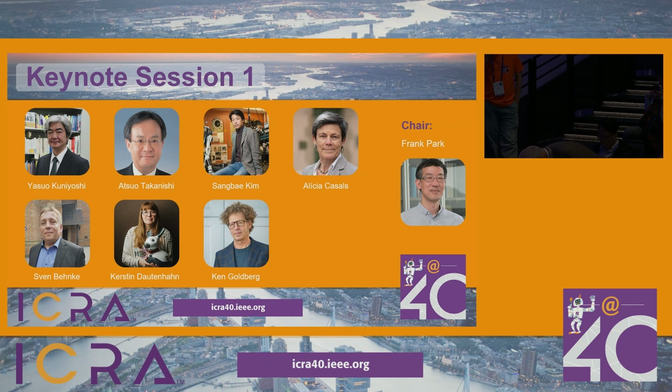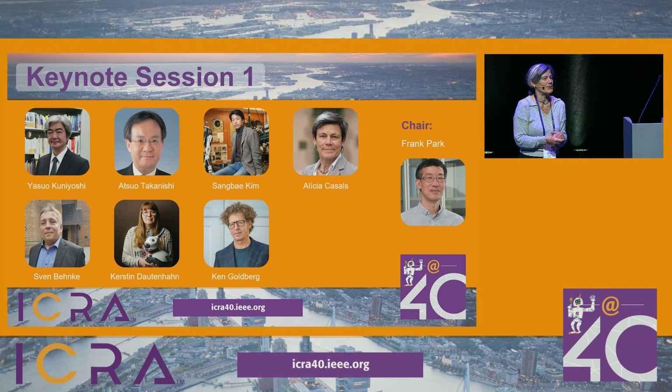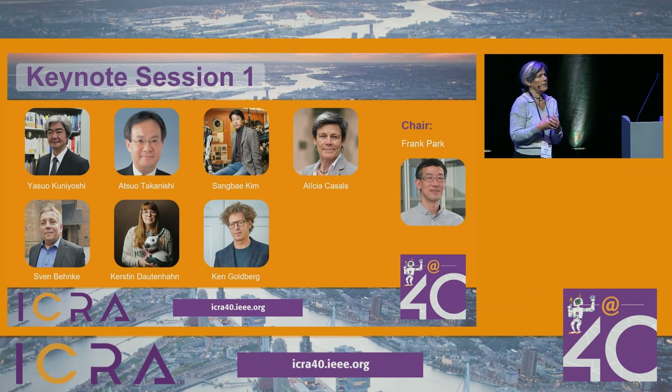Here I was talking about redundancy, but of course, haptics is the effort that all researchers of all the robots are trying to introduce. The problem in general is how to detect the force at the tip of the instrument, due to incompatibilities, miniaturization, and other parameters. There are different ways of measuring or estimating approximate force and giving some feedback.